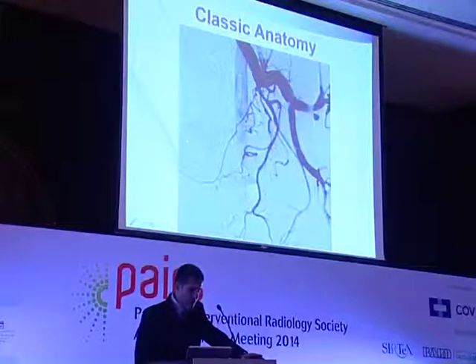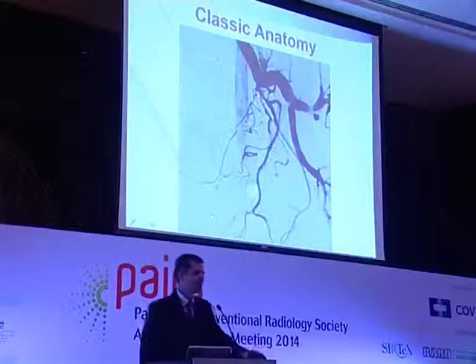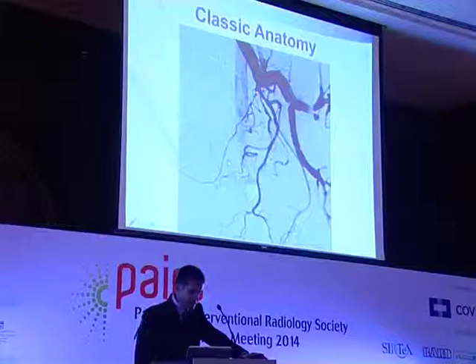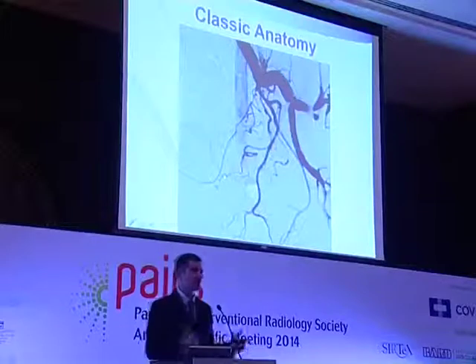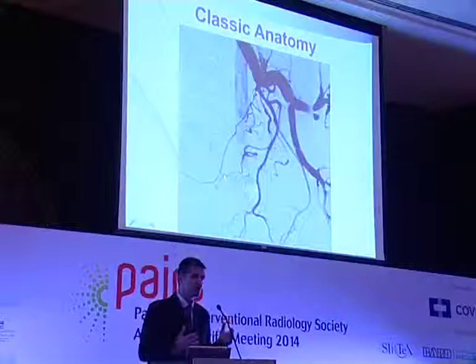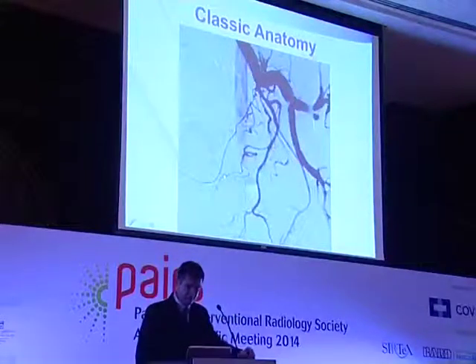The balloon is here, the catheter of the balloon is here, and we need to look at this position immediately below the balloon to see what artery is coming here. And this is the inferior vesical artery. What is the reason that we call it the inferior vesical artery? It comes from the urology view. They identify during surgery that the upper one is the superior and the lower one is the inferior.